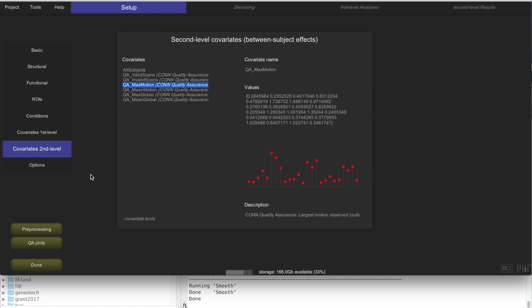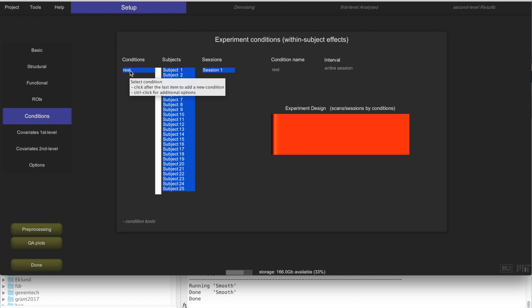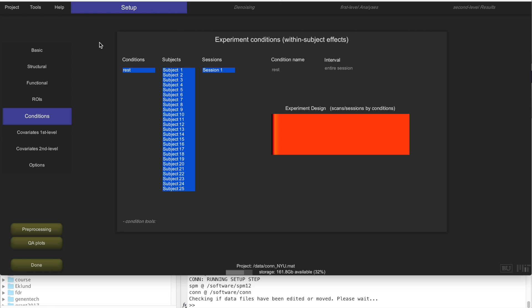All of this has been automatically done by preprocessing. At this step, if you have a more complex design — a pre-post design or a task design with different tasks within the scanner — you might want to specify your experimental conditions here. This is pure resting state data with a single session, so we are just defining a single condition called rest, encompassing the entire time series. The structural and functional data look fine, so we can move on to the denoising steps.